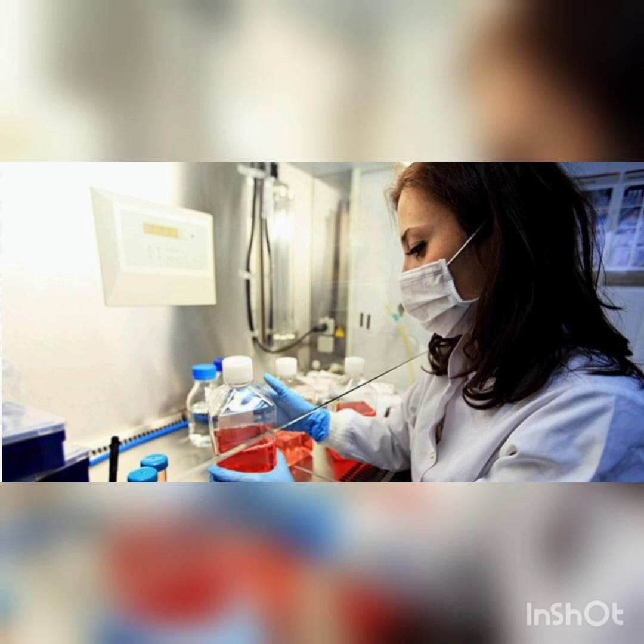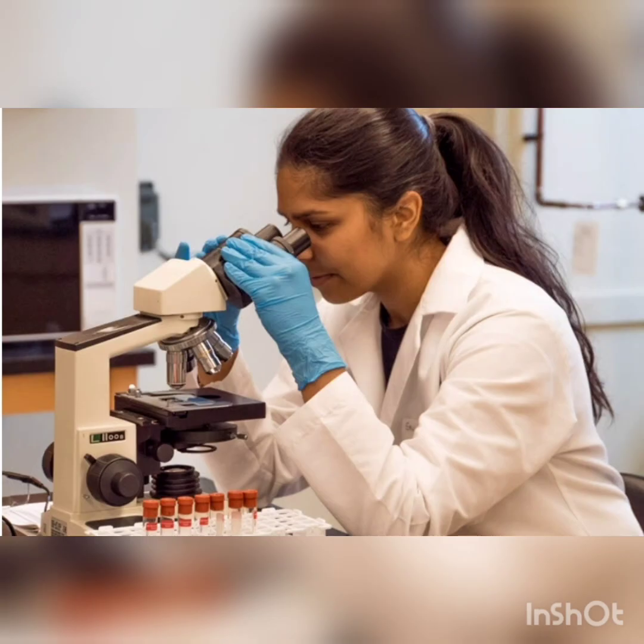So most of the time they keep it in a refrigerator at a temperature of 4 degrees centigrade to 6 degrees centigrade, as a safe and reliable method for storing.